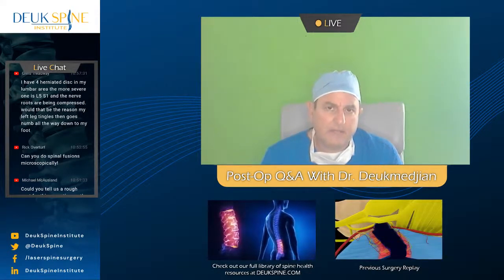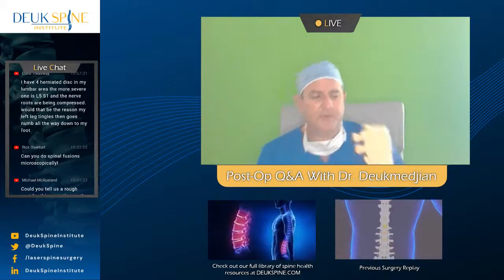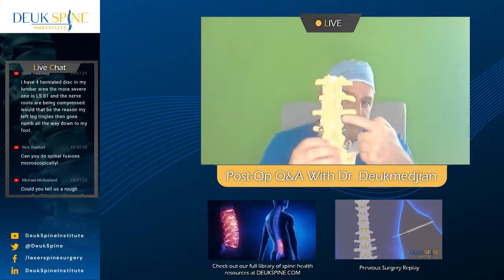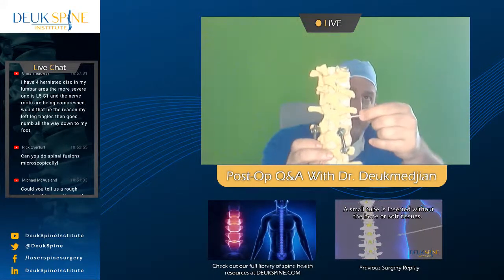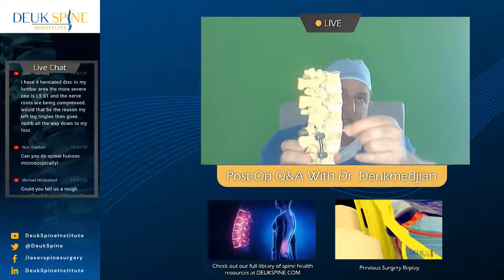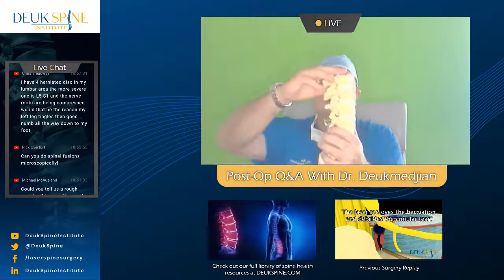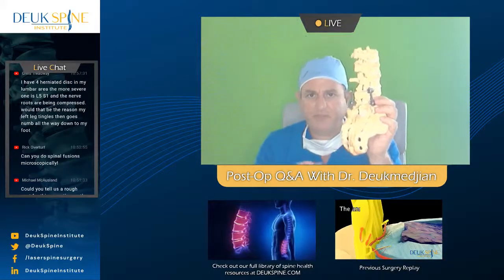But if you watch my fusions, and I've done over 1,000 lumbar fusions, there's something that I always do. If you look at this spine here, I always do an osteotomy. An osteotomy is when I cut through this bone back here called the facet joint, and I remove the entire facet joint. Why would I remove the facet joint? Because the facet joint gets so arthritic in most people that need fusion that it causes the spine to change its shape. So in order to put the spine back where it's supposed to be and fuse it in that perfect shape, you have to do an osteotomy called the Smith-Peterson osteotomy.